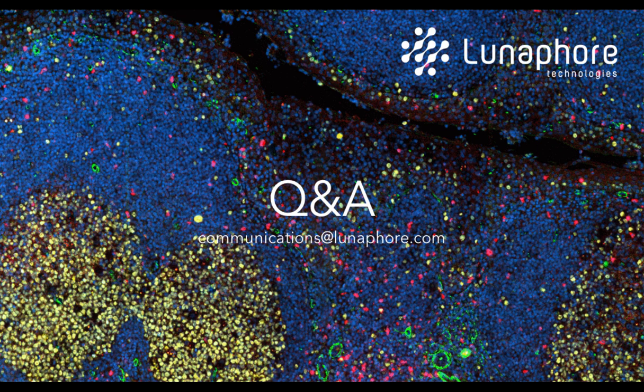Great. Another question on sample type. This question is asking, is this method restricted for use on specific tissue types, or can it be used on any tissue type? So we have experience with different tissue types, both normal tissue and cancerous tissues. So there is no restriction from that. And on top of this, we are very interested in frozen sections as well. We have plans of developing the staining on frozen sections, and we already have experience on the staining itself. I'm sorry, we are developing now the multiplexing protocol for them as well. Excellent.